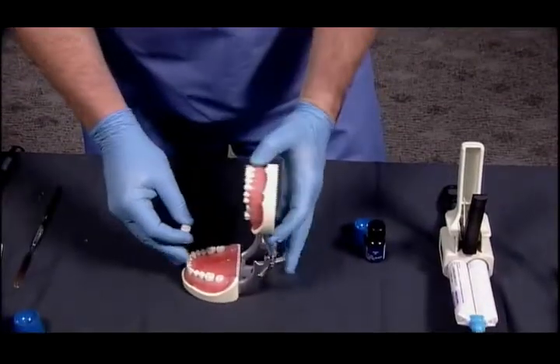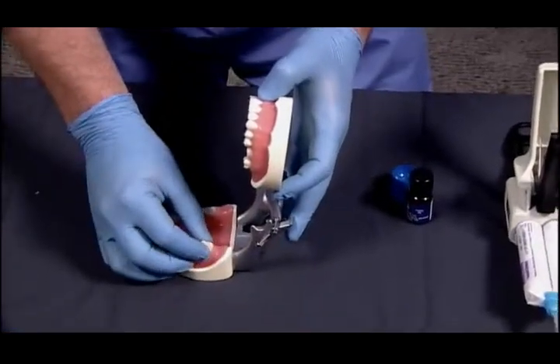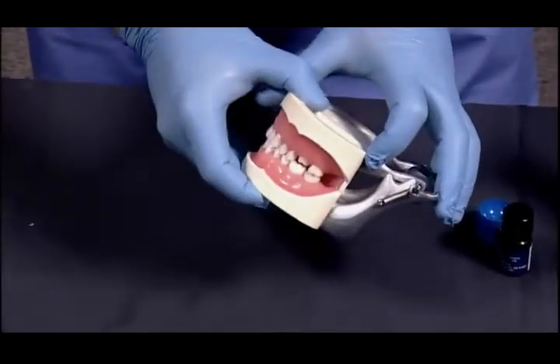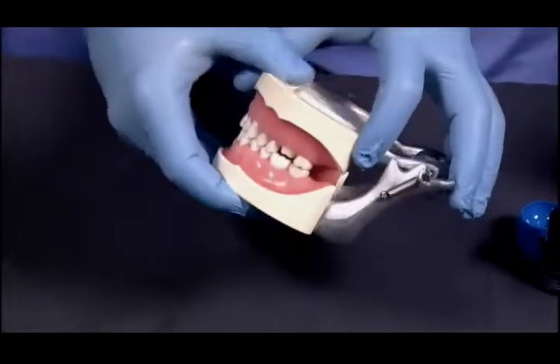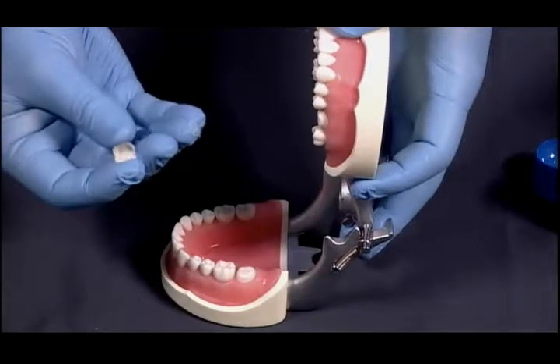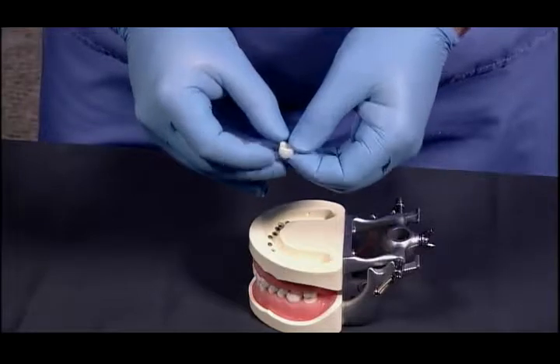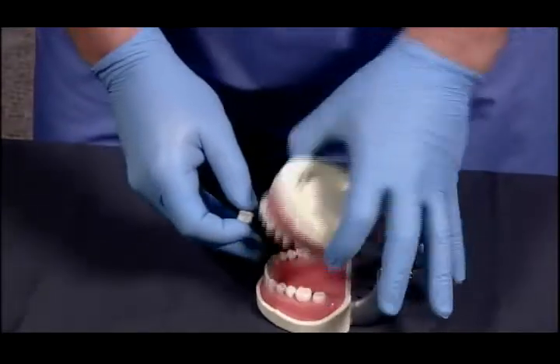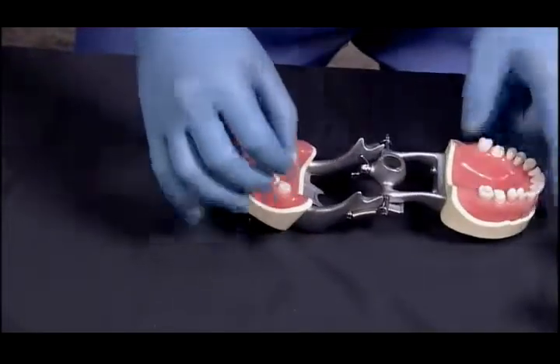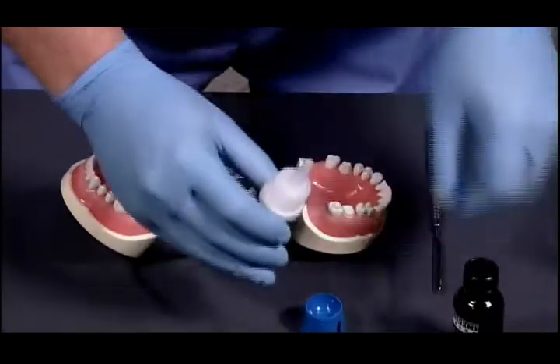All right, once we've trimmed and removed the tab from this temporary crown shell, what we do is go back to the patient's mouth and verify that we can get full seating in maximum intercuspation. And at this point is the time that you have to decide whether you're going to use the bisacryl technique or the acrylic technique. In the acrylic technique, you're going to take the trimmed and tab removed polycarbonate crown shell, take it back to the patient, verify that it seats all the way, and then we're going to line it with acrylic.